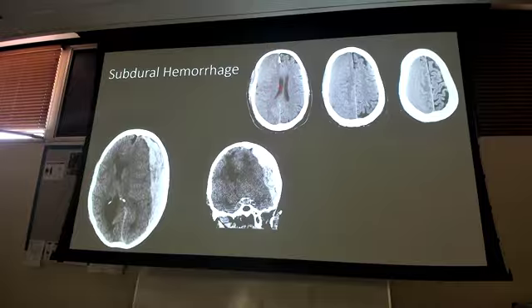Most of the bleeds I'm going to give you on the test are going to be acute bleeds. Why do I want to give you acute bleeds? Because at this stage, I need you to recognize acute bleeds, because those are the patients we need to act on. You'll learn how to act on them in neuro, in EMED, in surgery, and all that stuff. But you can't act on it if you don't notice it, right? So I will be giving you acute bleeds.